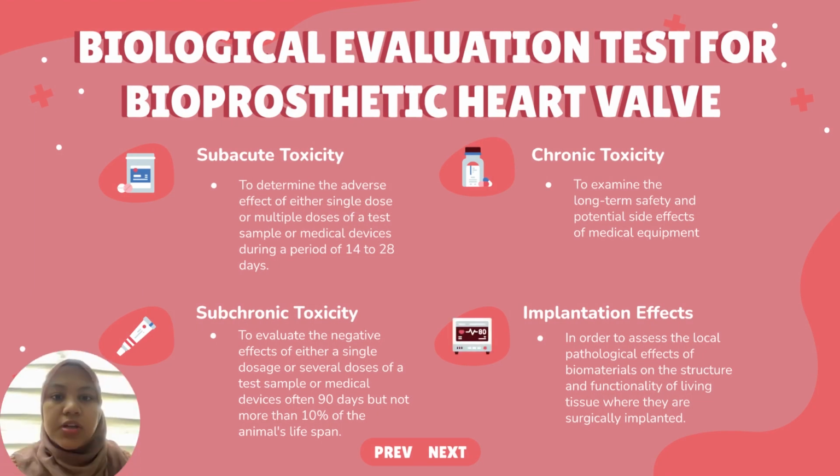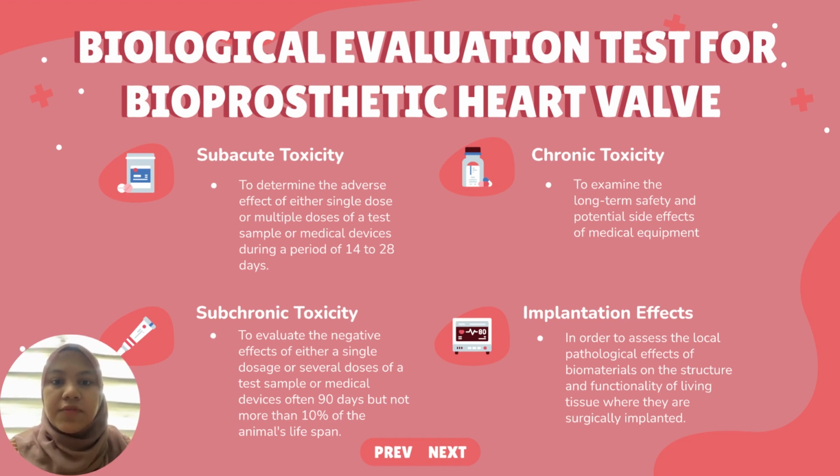Number 5 is subacute toxicity. It's to determine the adverse effect of either single dose or multiple doses of a test sample or medical device during a period of 14 to 28 days.